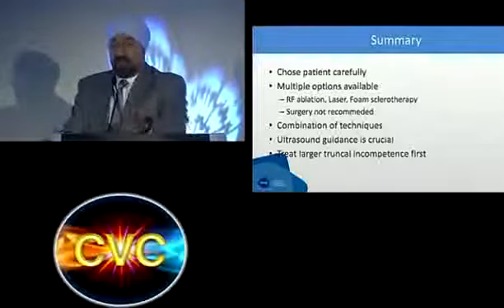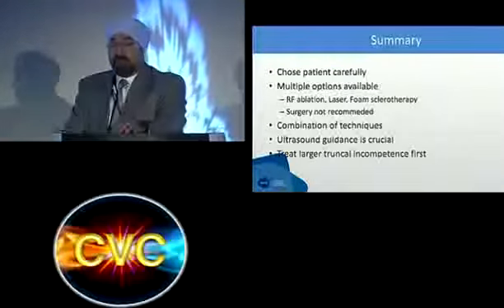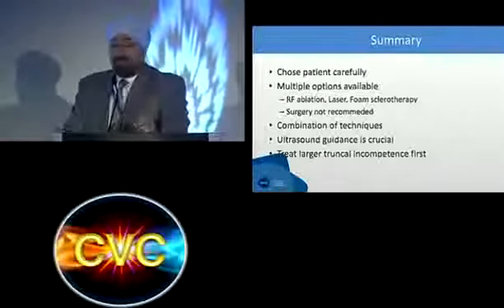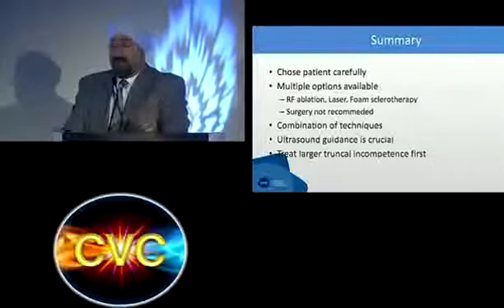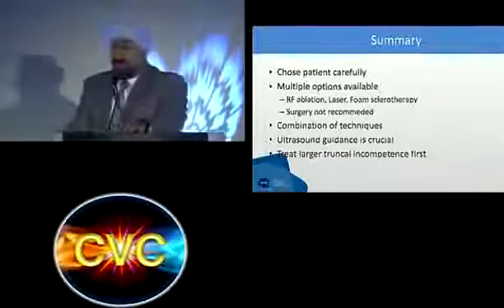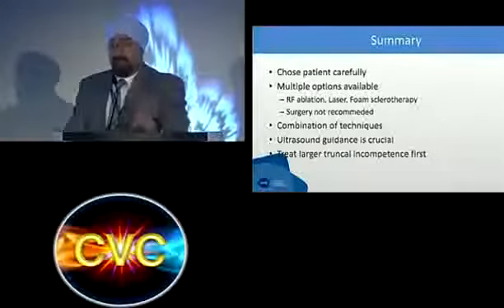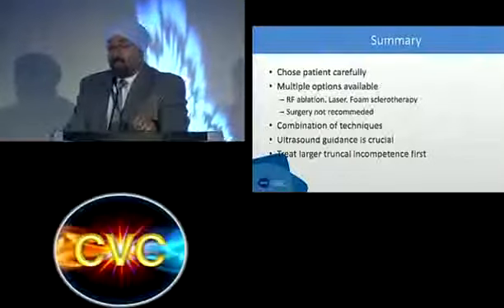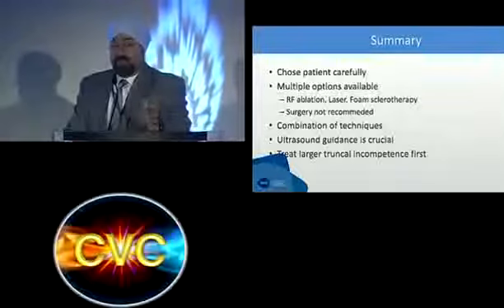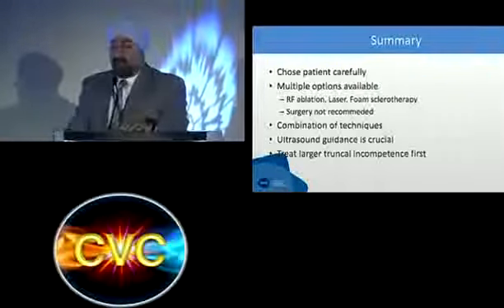Wanted to stay on compliance, so we didn't talk much about laser, but there are enough people who use lasers, including myself. We can put the fiber through the needle itself. I don't think anybody really does open surgery on this anymore, anywhere. But ultrasound, doing it yourself is absolute key, and going from there. And depending on what you're treating, but most of the time, I will do the truncal lesions first, make sure the overall pressure has decreased, and go from there.